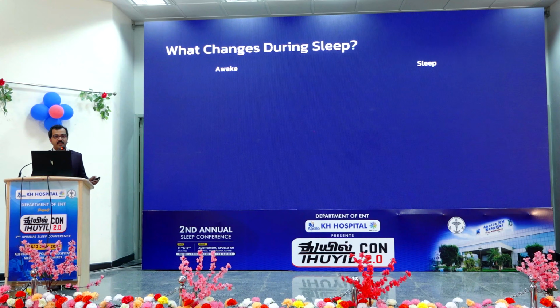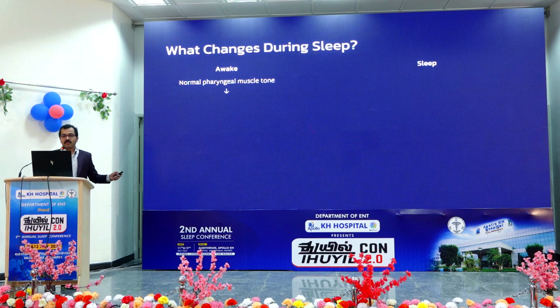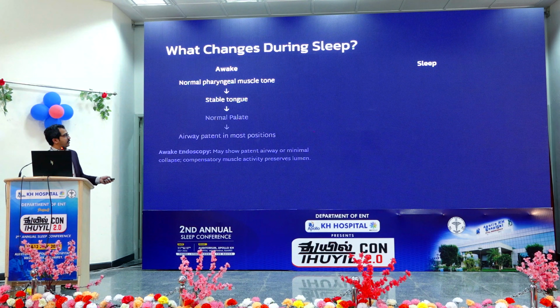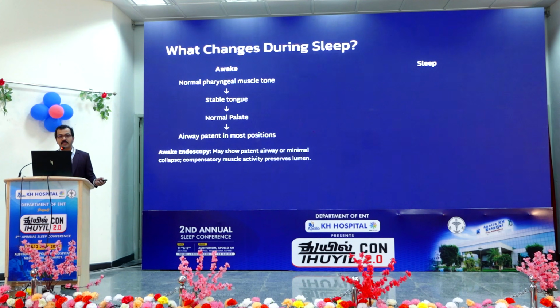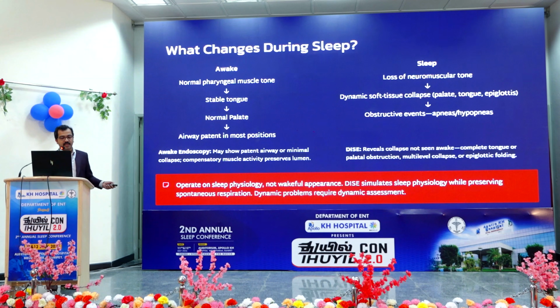So what is actually happening when the patient is awake? When the patient is awake, the pharyngeal muscle tone is very good. The tongue tone will be there, the palate is intact, and the airway is mostly patent. But when the patient sleeps, all the muscle tone is lost. There will be collapse of the oropharyngeal soft tissues and the tongue, leading to sleep apneas. So as a sleep surgeon, we operate on a dynamic anatomy. It should always be a dynamic evaluation which helps us decide which site to operate.